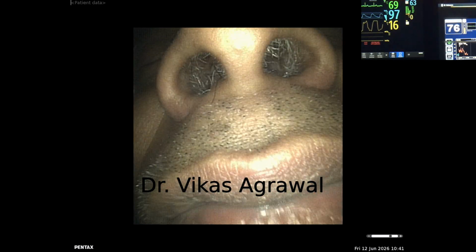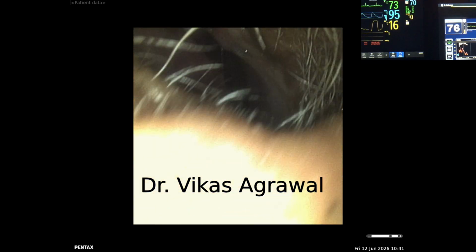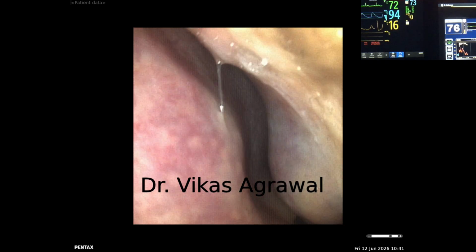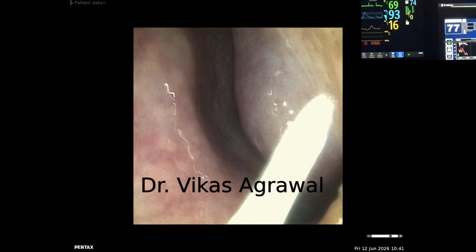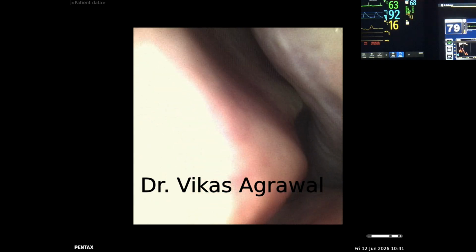So here you are watching drug-induced sleep endoscopy based monitoring in a 58-year-old male with history of snoring, choking. He is a CPAP user. His body mass index is 28, so he is a little overweight, and his AHI is 24, half of which are apneas and half of which are hypopnea.